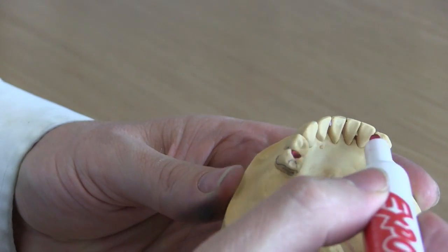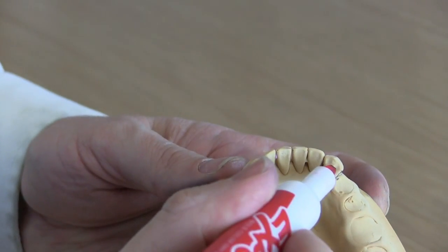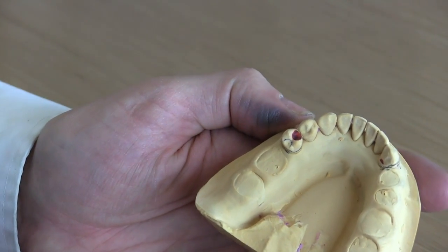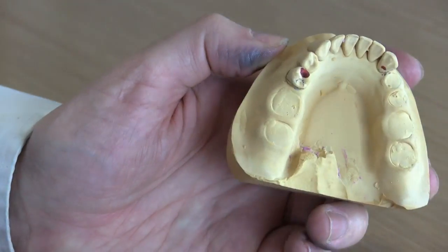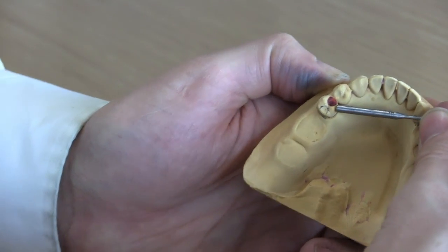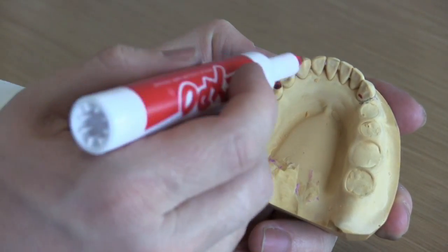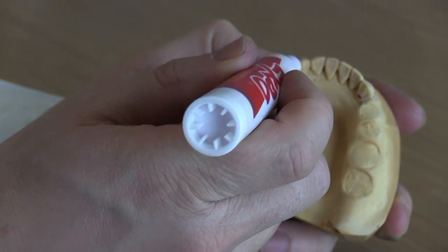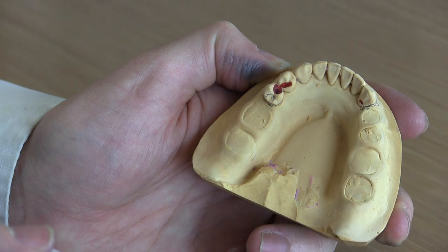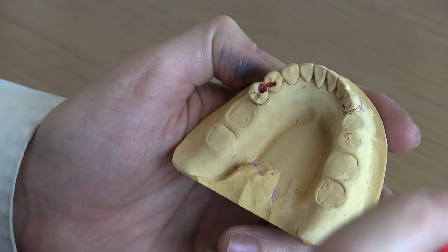The other tooth is a little bit tricky — we don't have a premolar. We've done premolar work so we have to use the anterior here because that's all there is. We're close to the pulp, we can't cut in very deep, and we can't be very high because this tooth is pitched. We are above the height of contour so it should be supporting, but look at the angle — we are on a wedge. These two areas will create a fulcrum right there. As we bite on the back it'll lift the other teeth, and as we eat sticky food it'll tip forward. So we're going to create what's called indirect retention — I can do that just by adding a little clasp going off the front. As it's starting to rock up, this little guy will stop it. We'll be fulcruming around those two rests, and that little guy will stop us from rocking as we eat sticky foods. We'll talk more about indirect retention in class, but that's a good visualization of what it would look like.